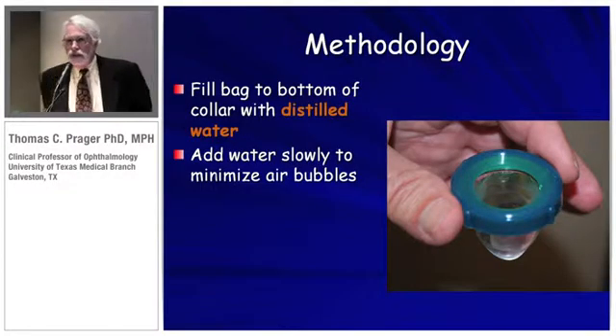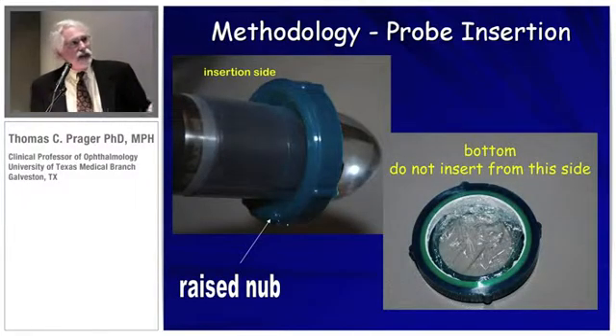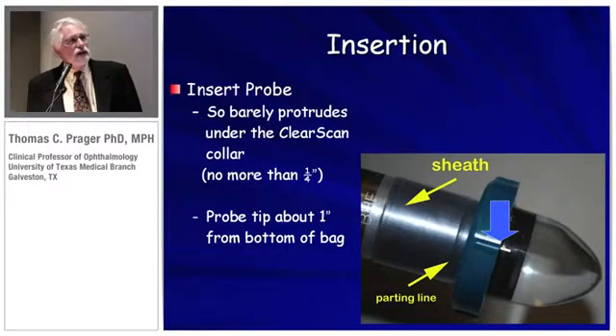The methodology to use this is actually pretty simple and very fast. I always use distilled water because tap water has minerals in it and they can deposit on the end of the probe, which would be a very expensive repair. Add the water slowly to minimize the formation of air bubbles. Note there are two sides — here's the bottom side and here's the insertion side. There's a little raised nub to indicate that's the insertion side. Inserting in the wrong end can possibly result in leakage.